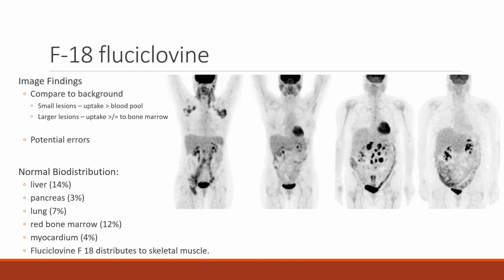All right, image interpretations that occur. A negative scan, this is where the drug company made their mistake. A negative scan does not rule out the presence of recurrent prostate cancer, and a positive scan does not confirm the presence. So they shot themselves in the foot with that little caveat in the package insert.